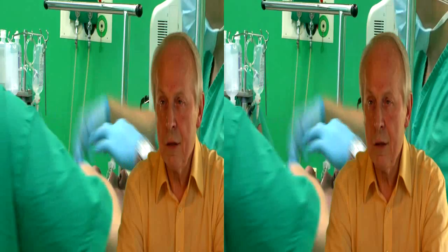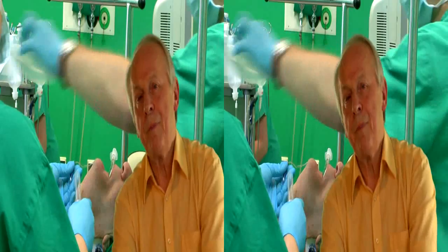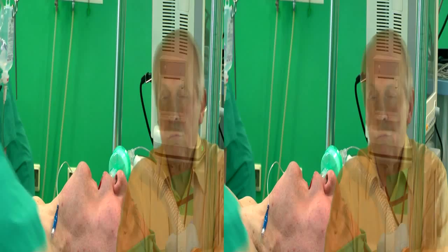Również do tętnicy promieniowej z nakłucia wprowadza się kaniulkę, za pomocą której monitoruje się ciśnienie tętnicze krwi metodą krwawą. Również do żyły podobojczykowej albo do żyły szyjnej wprowadza się kolejny cewnik, aby mierzyć ośrodkowe ciśnienie żylne i podawać również leki tą drogą.